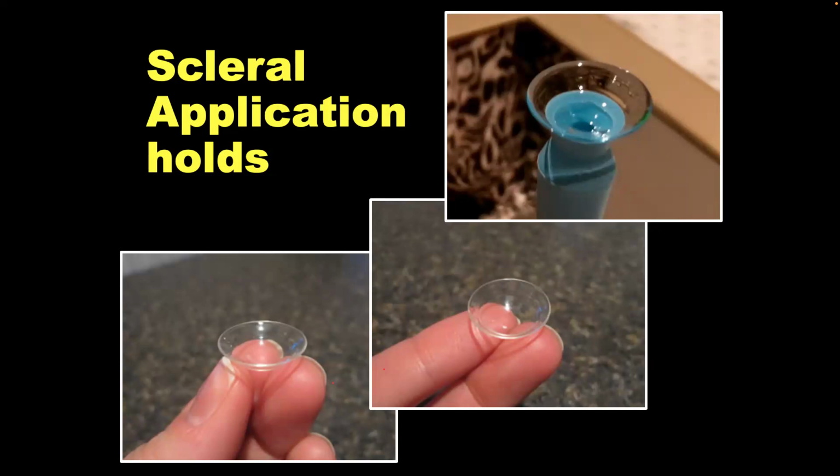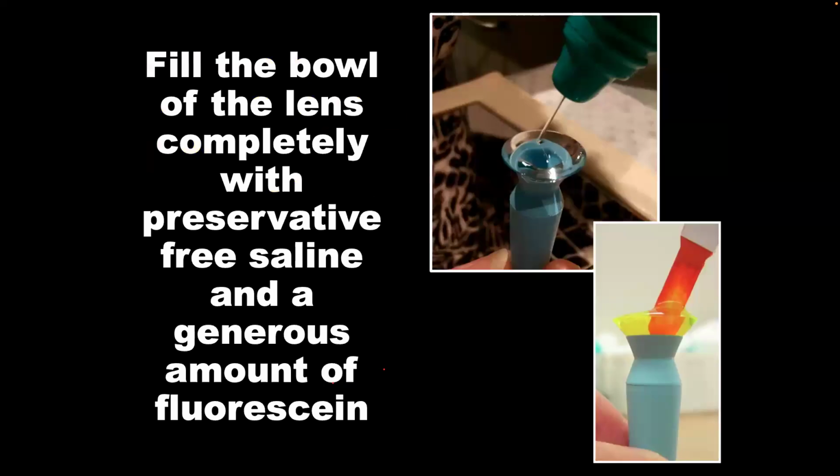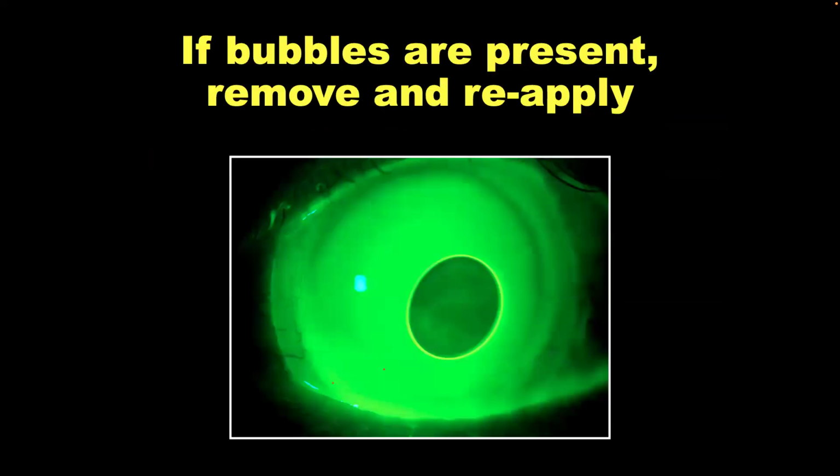Just remember that the tripod is more stable than two fingers, because of filling it out with saline solution, and this could be a little bit of a mess if you don't put it on quite well. Then, just a brief reminder: fill the bowl, put fluorescein, and assess. And if bubbles are present, remove and reapply.